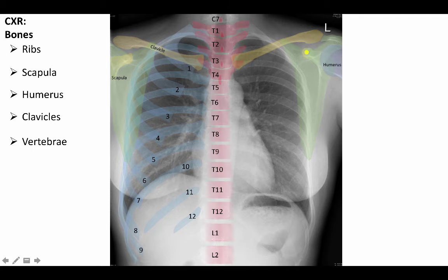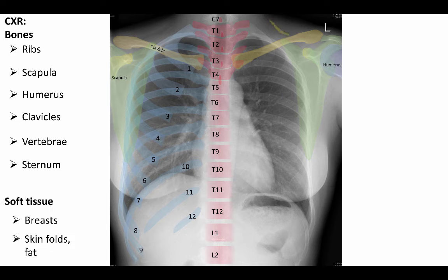The vertebrae are visible in the midline. We can especially see the spinous processes of the vertebrae along the midline. The sternum is often obscured by other midline structures and is not visible here. Soft tissues such as the breast, nipples, skin folds, and sometimes adipose tissue between muscular layers, are also visible.